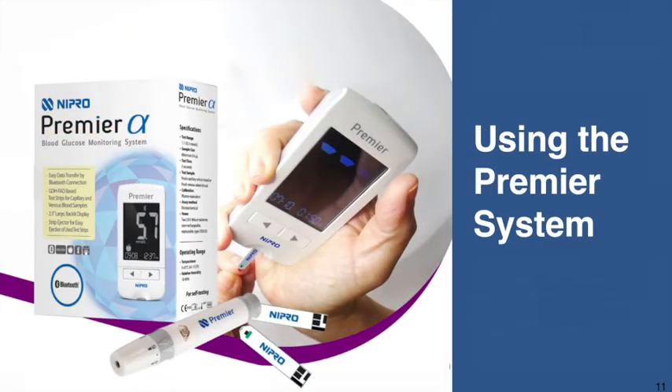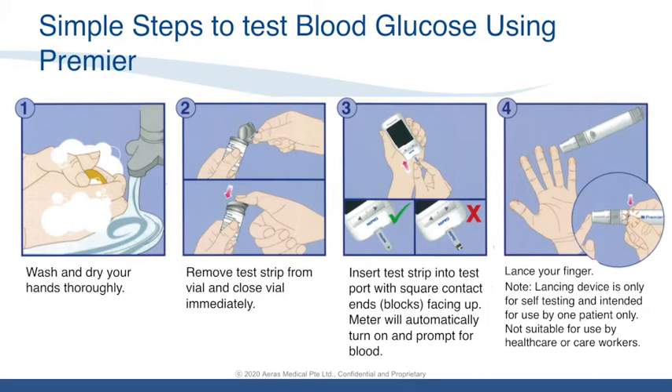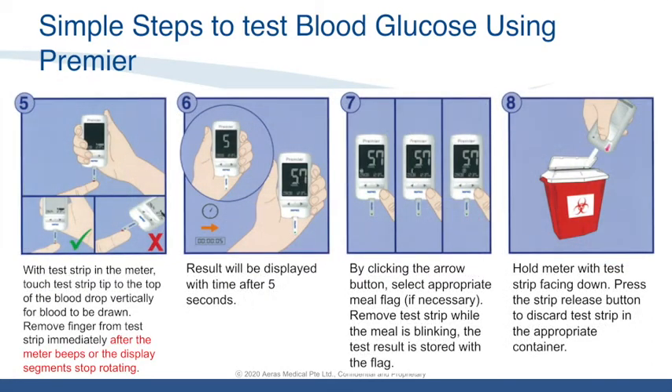Using the Premier system, the first step is always to wash and dry your hands thoroughly. Then remove the test strip from the vial and close the vial immediately. Insert the test strip into the meter — the meter will automatically turn on and prompt for blood. Lance your finger, then touch your finger to the blood glucose meter. Remove the finger from the drop of blood only after the meter beeps or the display segments stop rotating. After results are displayed, use the arrow button to indicate meal flag. Remember to do this before ejecting the test strip. Finally, discard the test strip using the strip ejector.